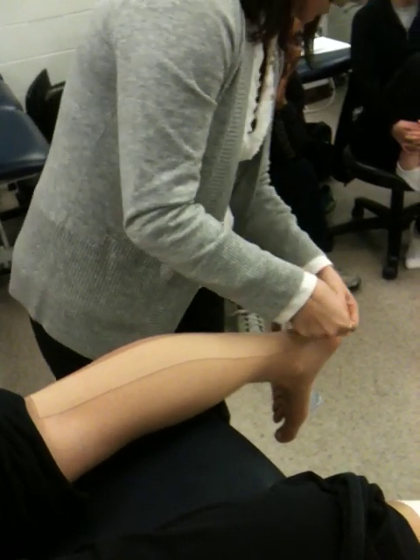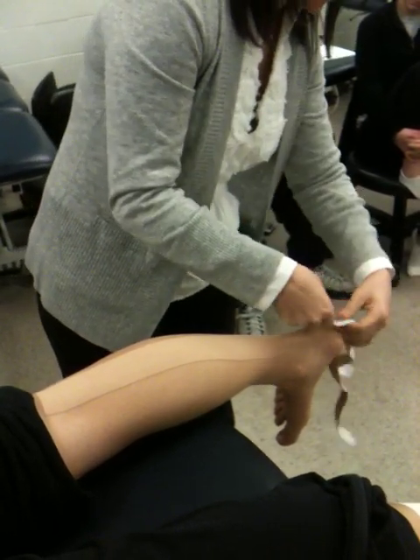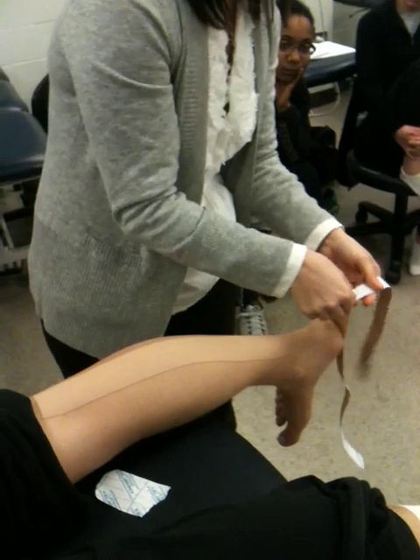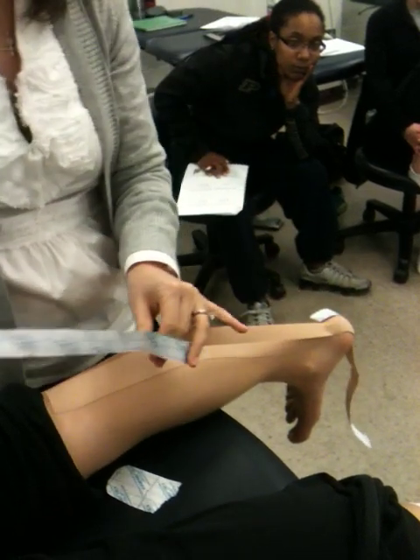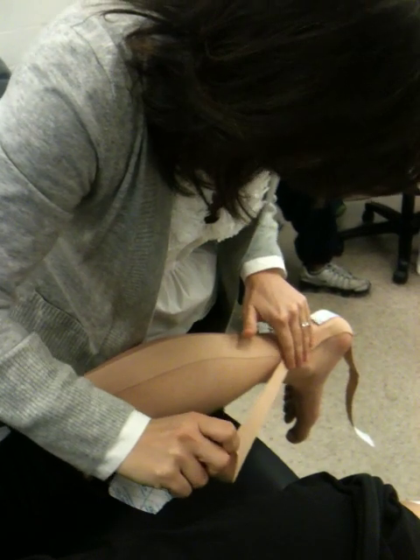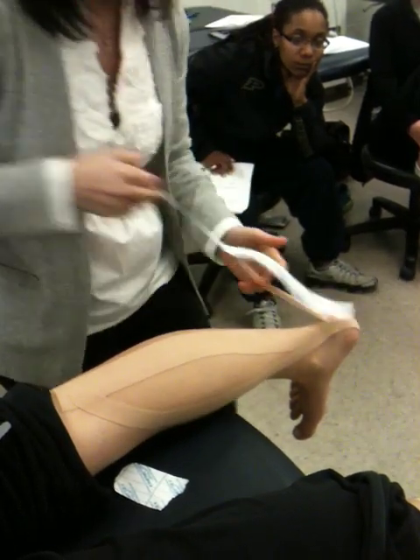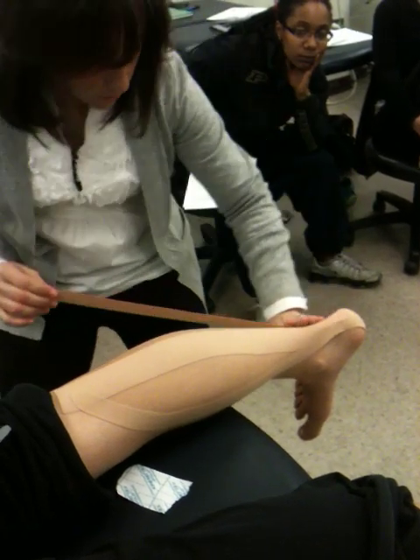I'm going to rip off my tails so they're free — keep the tape on until you're ready to work. I'm going to use the medial tail and come around knowing exactly where that gastroc is, going to the outer borders and wrapping it around. Then I'll take my second tail and take it to the outer border and in.